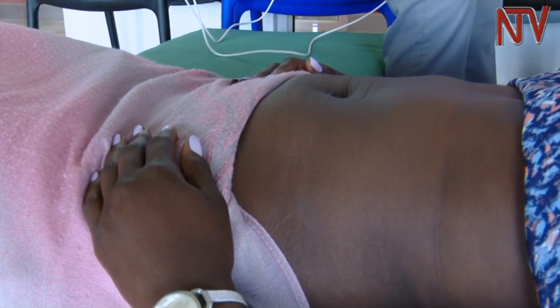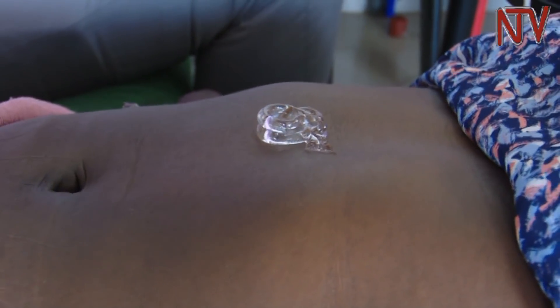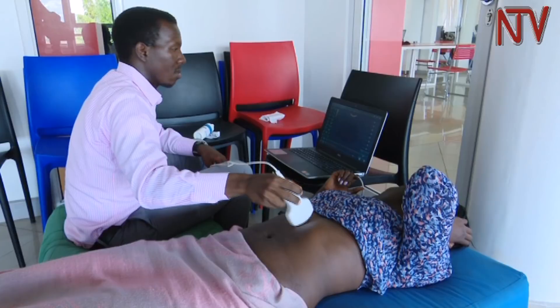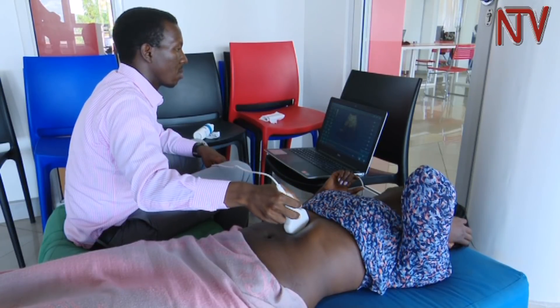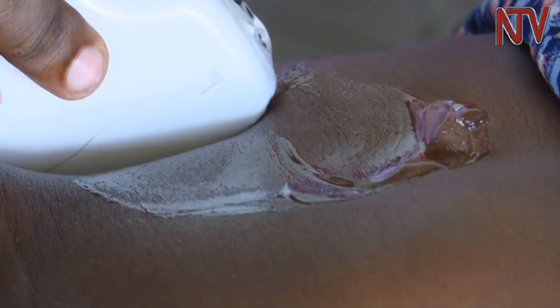Menu applies an ultrasound gel to the body part to be scanned. In this case he is looking at the liver and the kidneys. The ultrasound gel removes air bubbles between the skin surface of the patient and the probe.